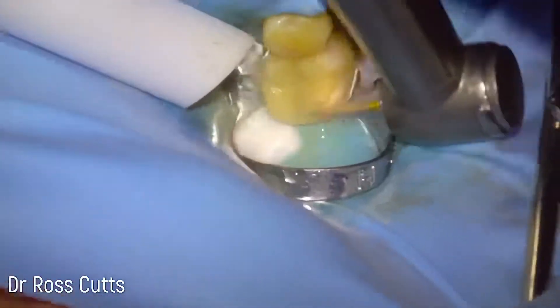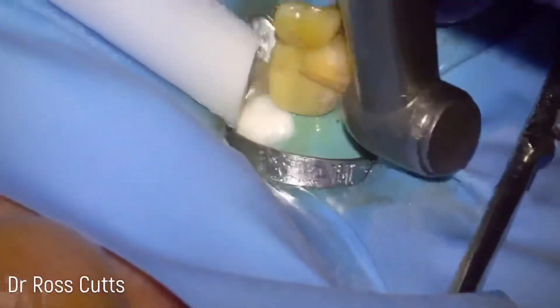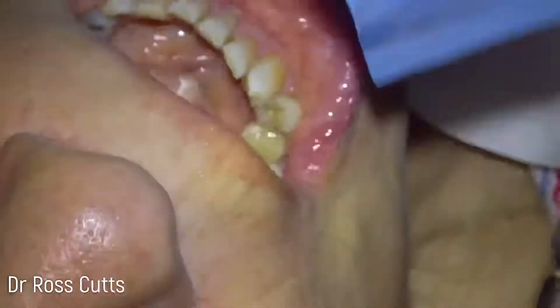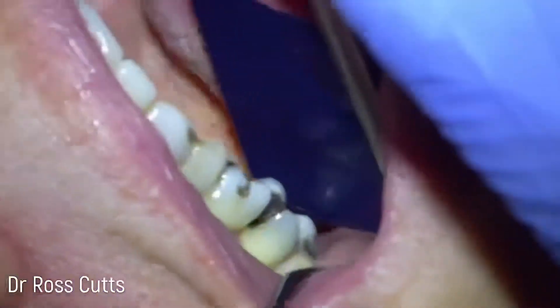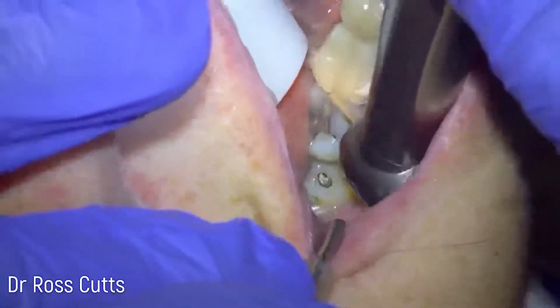Now we've got a little diamond polishing burr and we can start shaping the tooth. I like to over-build and then recontour using a handpiece, whereas some clinicians prefer to try and get the final shape directly. Then we take the band off and we can start checking the occlusal form and make any adjustments as necessary.